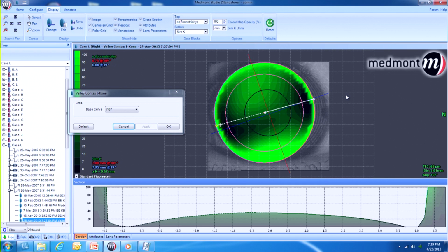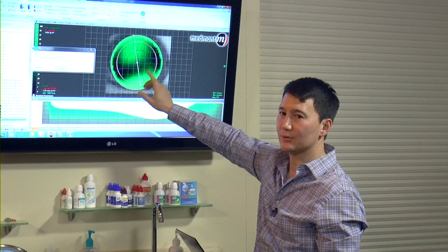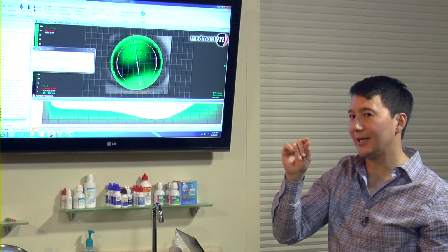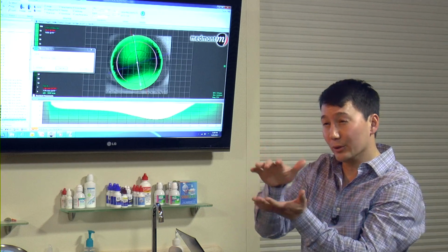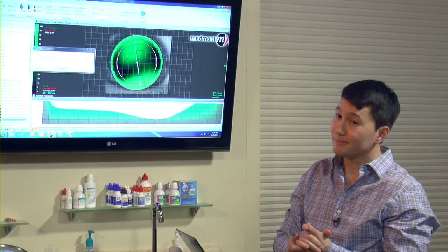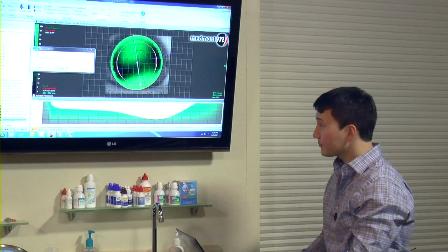The vertical meridian, it could be problematic. We may get a bubble down here. It may be lifting off so much that inferior lid may just grab the lens and want to pop it out. But because there's hope, I might try a corneal GP. Again, if scleral didn't look like it was going to be possible. If we had a real small deep set fissure, small fissure patient with a real deep set eye, maybe scleral wouldn't get in there, so corneal GP would be the right call.